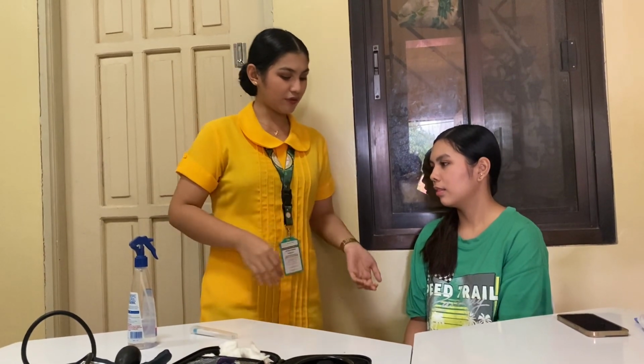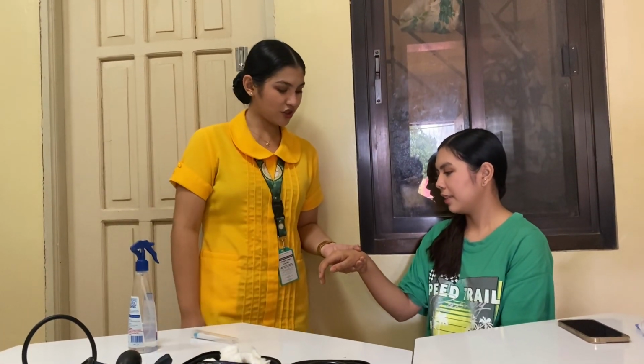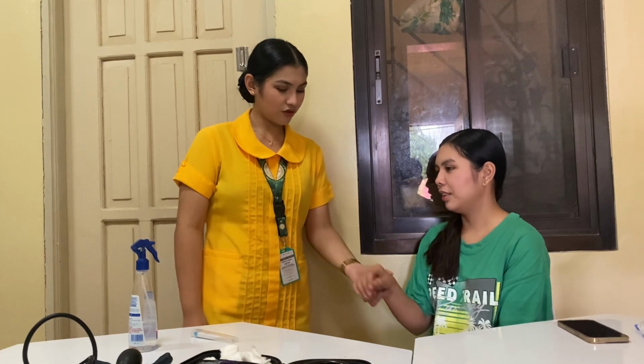So good day, ma'am. I am Shamel B. Tobias, a student nurse from Muslim University, Philippines, and today I am here to assess your vital signs. This includes your body temp, your respiratory rate, your pulse rate, as well as your blood pressure. So first, we'll be assessing your body temperature. For safety purposes, may I hold your hand as I check your ID band? Kindly tell me your name and age. I'm Hannah, 18 years old. Okay, thank you, ma'am.